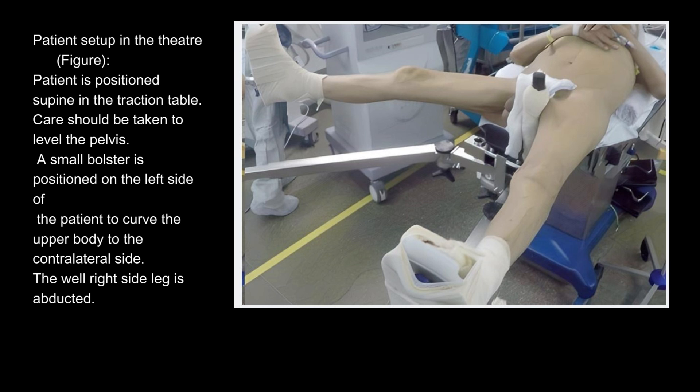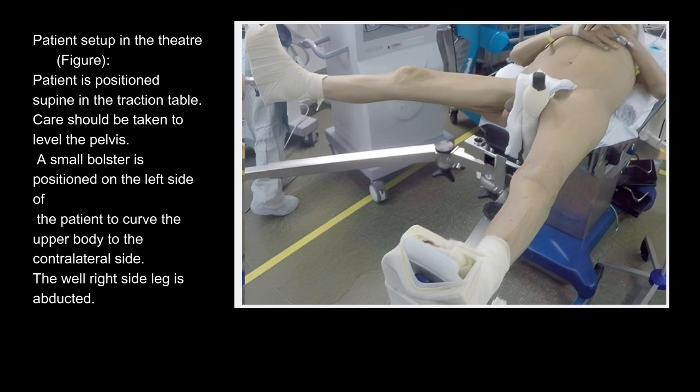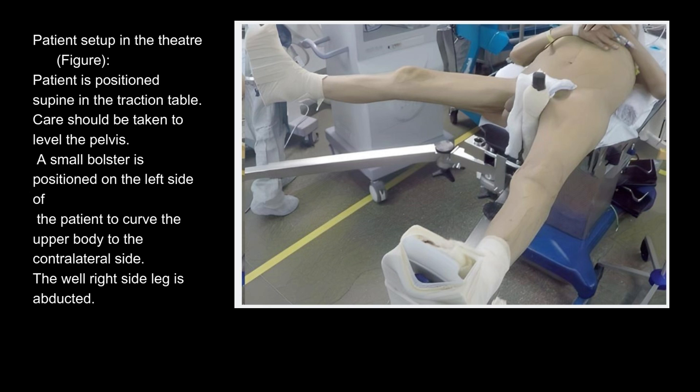Patient Setup in the Theater. The patient is positioned supine on the traction table. Care should be taken to level the pelvis. A small bolster is positioned on the left side of the patient to curve the upper body to the contralateral side. The well right side leg is abducted.